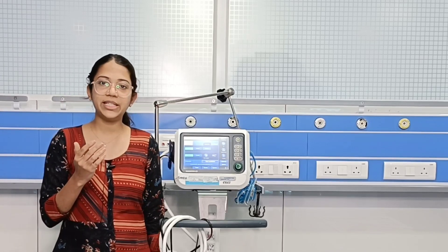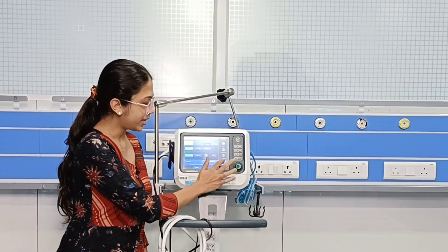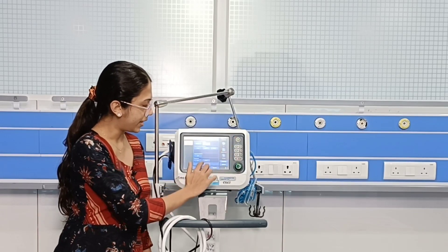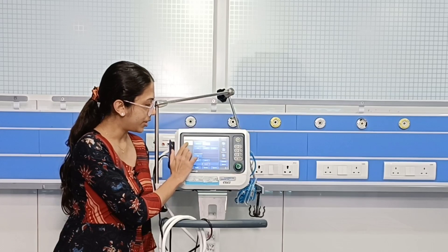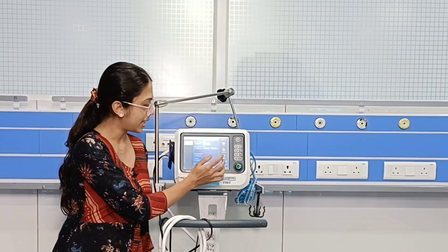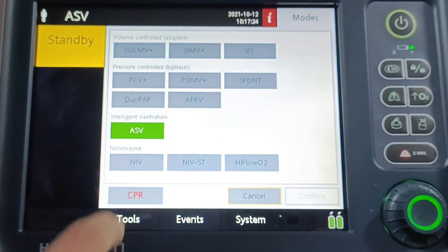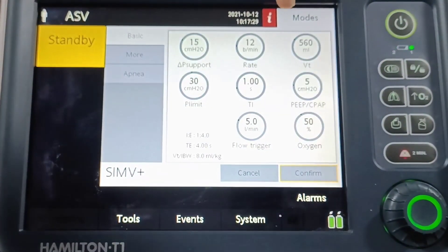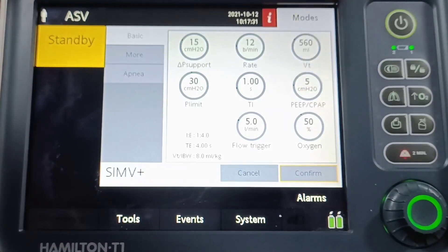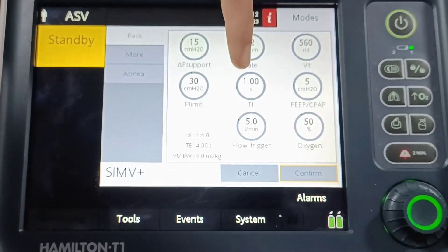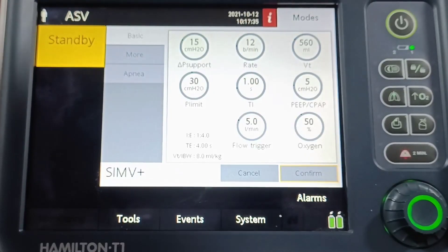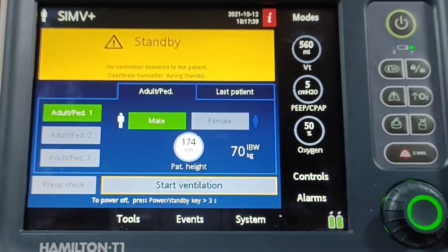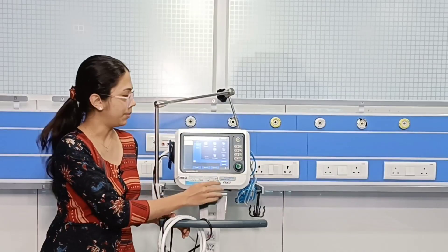In the modes menu, under volume control or pressure control modes, we will find SIMV. Once SIMV is selected, we set the tidal volume, PEEP, FiO2, respiratory rate, I:E ratio, and the trigger. Usually we keep a very low trigger because it is a weaning mode.